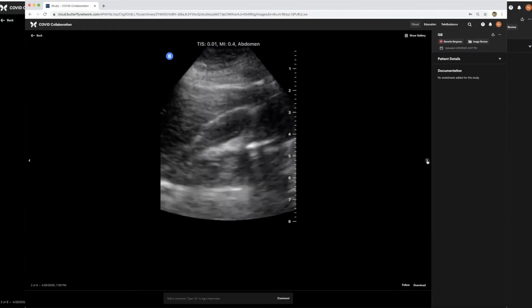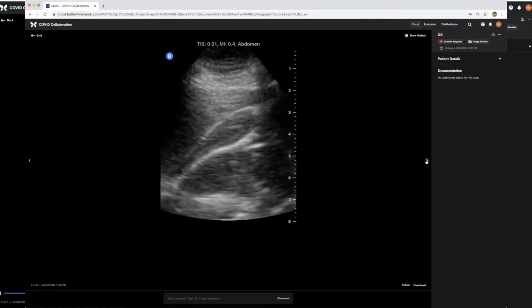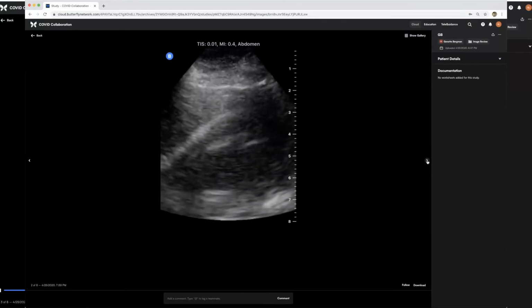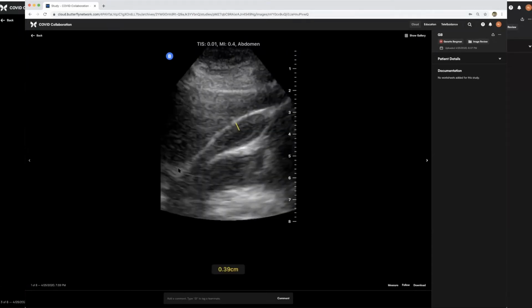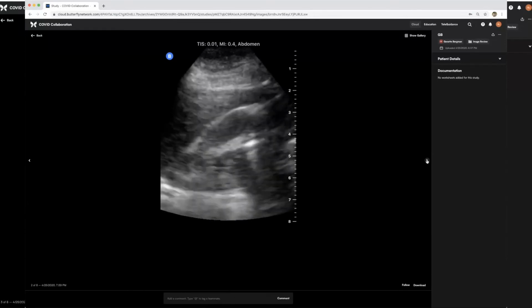Yeah, a great point, and a couple of great teaching pearls that you just dropped there casually. One, if you're going to measure the gallbladder wall thickness, measure the anterior wall, exactly as you mentioned. And two, when somebody comes in for their scheduled outpatient gallbladder ultrasound, they're instructed not to eat after midnight. That's so the gallbladder can distend and you can get a better image. But that wall cutoff of 3 millimeters as a normal wall thickness really applies to that population. And if you're looking at somebody who's just eaten, here's somebody with a 4 millimeter wall, but it would be completely normal because it's just a contracted gallbladder and the wall's thicker as a result.